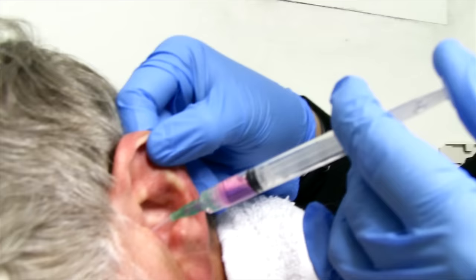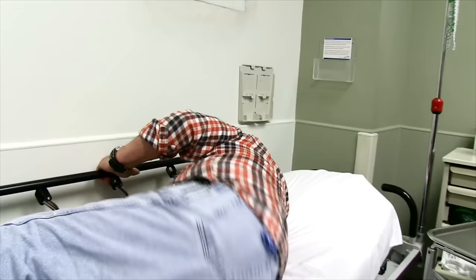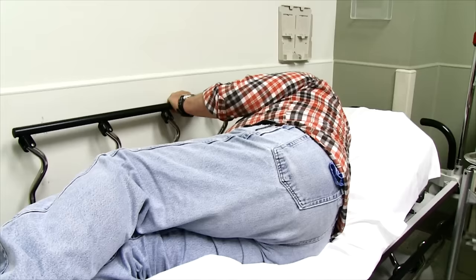So this is the Colace — we just drop a couple of drops back in here. Now I'm gonna let him lie down so he doesn't get a crick in his neck. I'll wait again, probably another 15 minutes or so, and let that soak in, and then we'll come back and repeat.